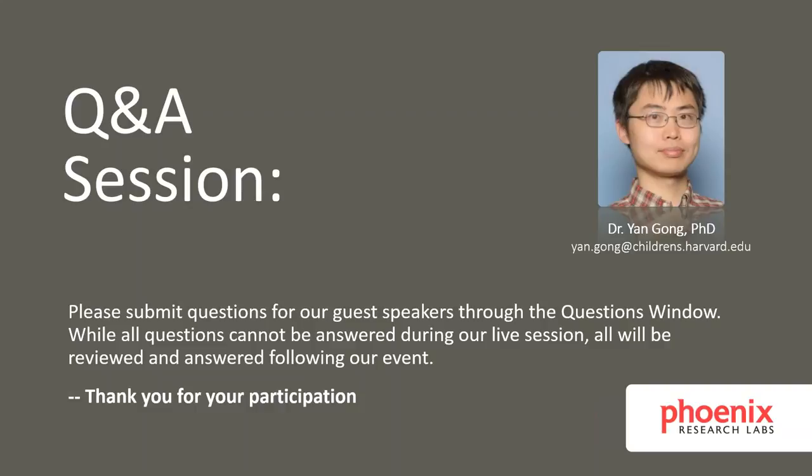Okay, great, thank you. And how are you evaluating the CNV with the OCT module? How are you setting that up? Both two- and three-dimensional OCT can be used to assess the lesion area maybe 7 days after the photocoagulation. The 2D could image the area of the laser-induced lesion, and the 3D OCT could measure the volume of this lesion area. And maybe Scott can give more detailed information about how we're using the OCT to measure a specific area in the mouse eye or in the eye of some small animals.